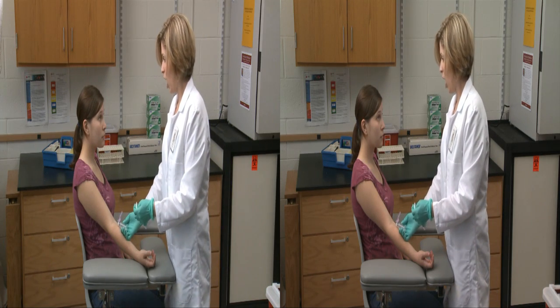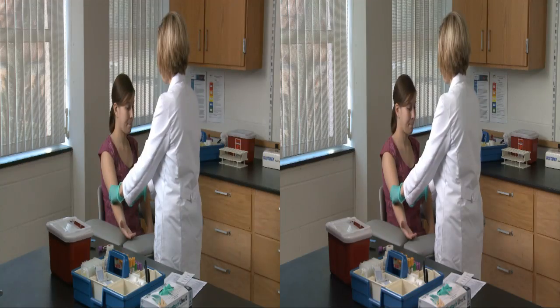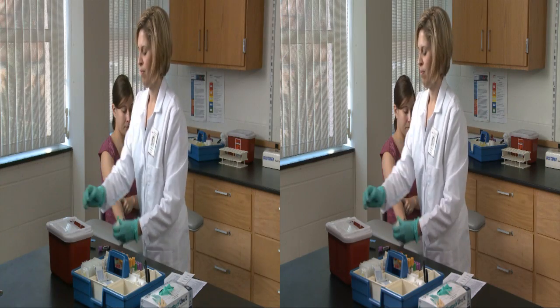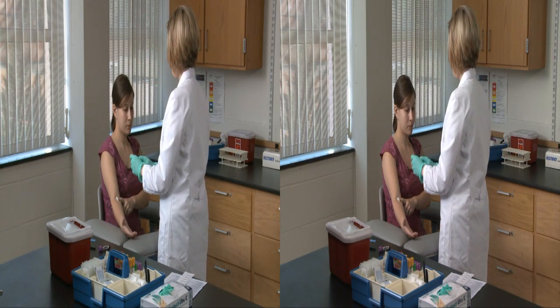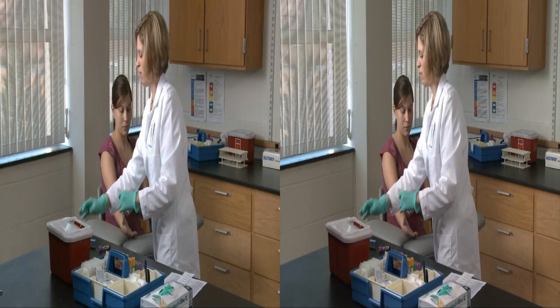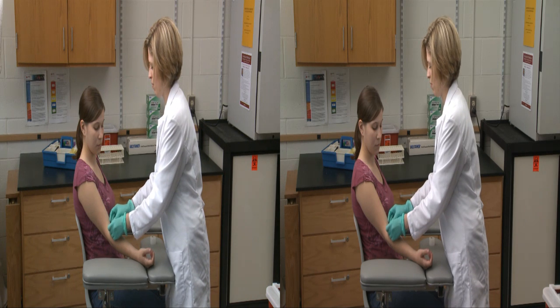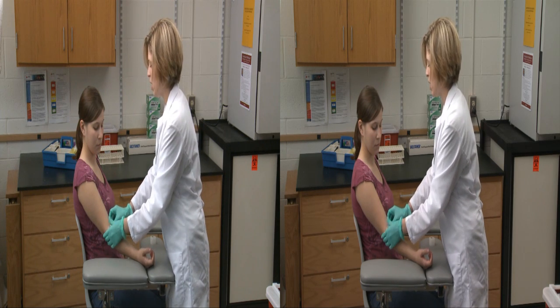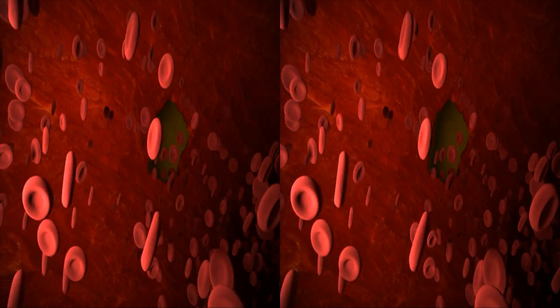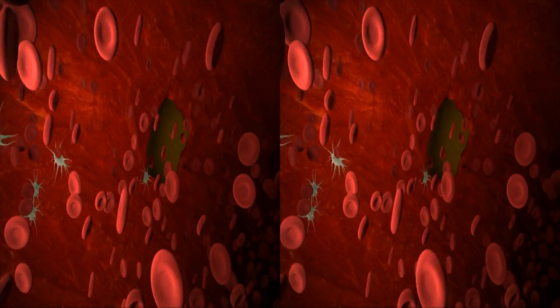We're almost finished here. Are you doing okay? Fine. Engage the safety device on the needle and use the sharps device for proper disposal. Applying pressure at the needle entry site immediately after removing the needle will prevent a hematoma from forming and allow hemostasis to seal the wound. Please keep pressure on the gauze pad for several minutes to ensure that the blood flow stops. In this illustration, you can see formation of the platelet plug and the fibrin clot.